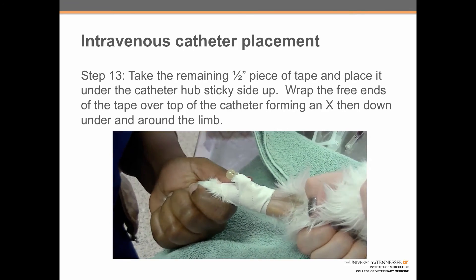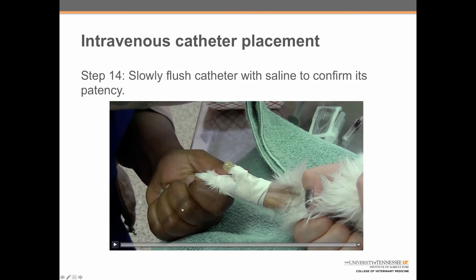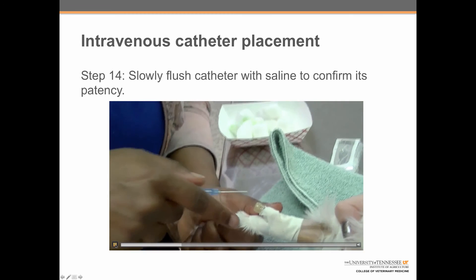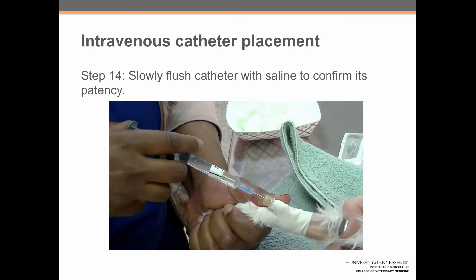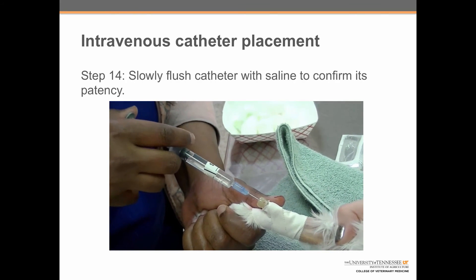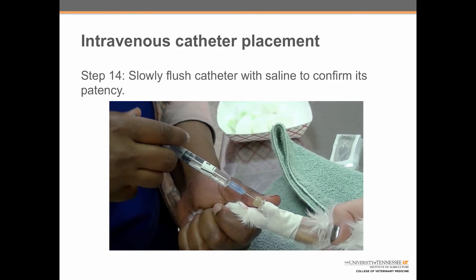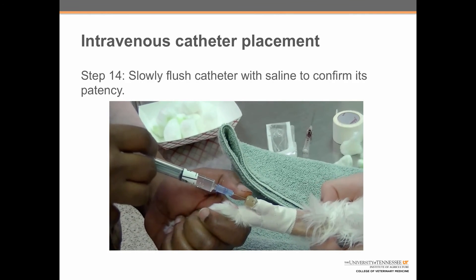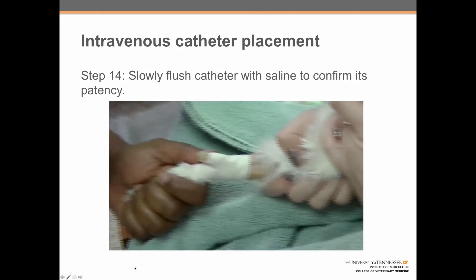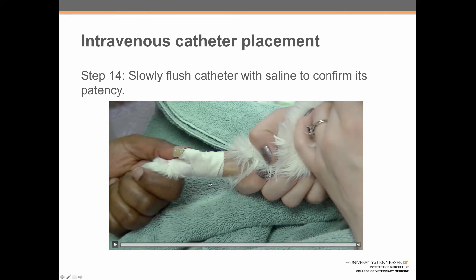Finally, after securing the port, slowly flush the catheter with saline to confirm its patency. It's important to note that steps 10 through 14 are all done quickly to make sure the catheter doesn't clog. Shanna injects fluid through the injection hub to confirm it is flowing freely, and there is no evidence of the vein blowing that would suggest the catheter has come out of place.